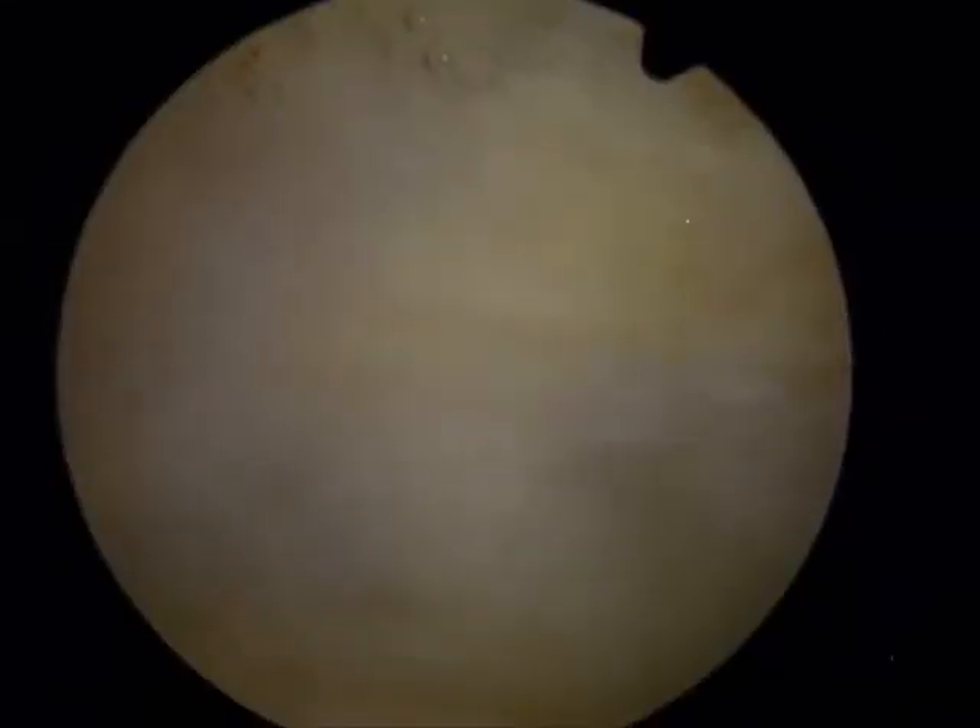So what I'm going to do is show you arthroscopically how to deal with this suprapatellar plica that's causing all the fluid to be retained above her kneecap. Here's the wall of tissue we call a suprapatellar plica.